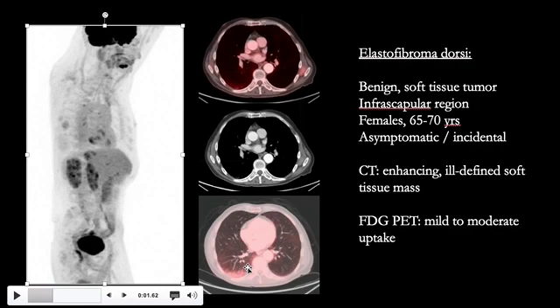Elastofibroma dorsi is typically seen in females aged 65 to 70 years. It's typically asymptomatic and frequently incidentally seen on imaging. On CT, there is an enhancing ill-defined soft tissue mass in the infrascapular region. About 60% of the time this is bilateral as a finding, and on FDG PET CT scan it may show mild to moderate FDG uptake.